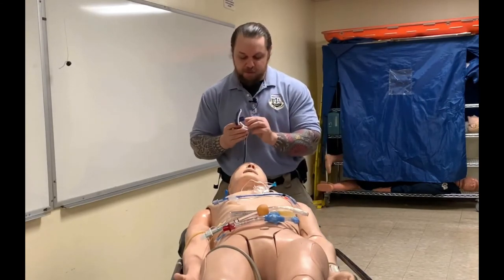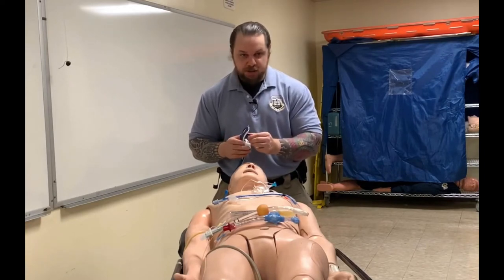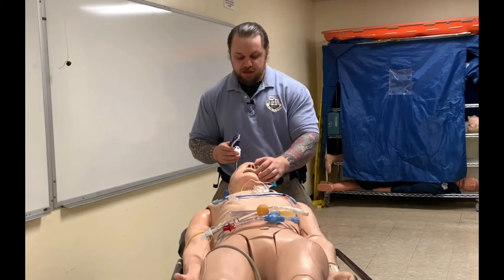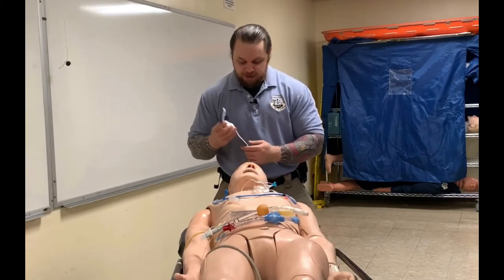At the bottom we have a bite block, and this is important: if the patient's level of consciousness goes up and he starts to try to close his mouth, you will not have a kink in the tube. The bite block prevents closure of the teeth and prevents kinking of your tube.